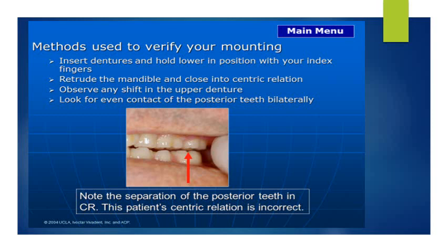Like in this slide, as you see the spaces between the teeth, the separation of the posterior teeth in centric relation. This represents centric relation. So this centric relation is incorrect.